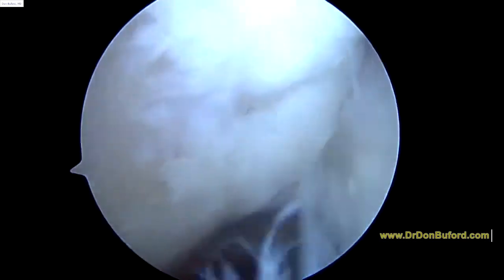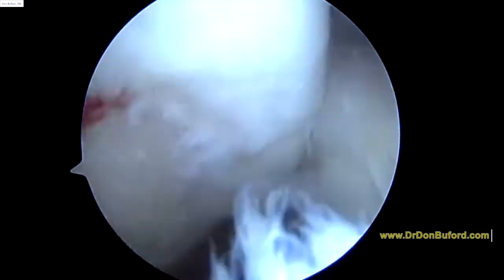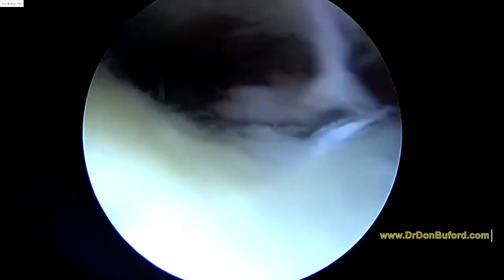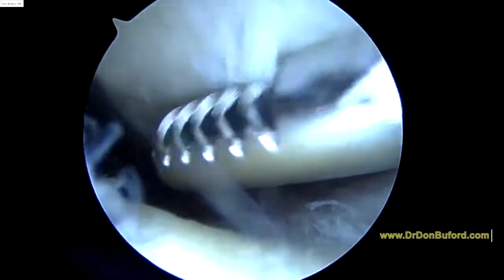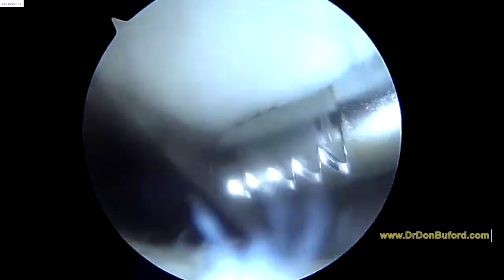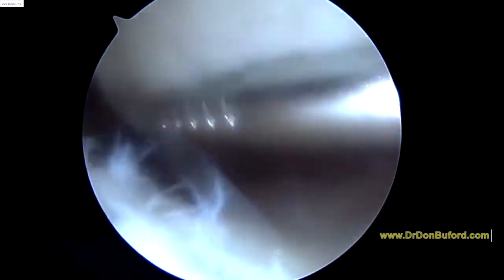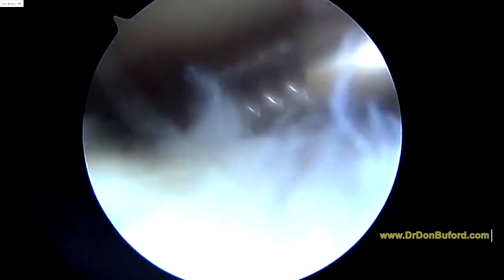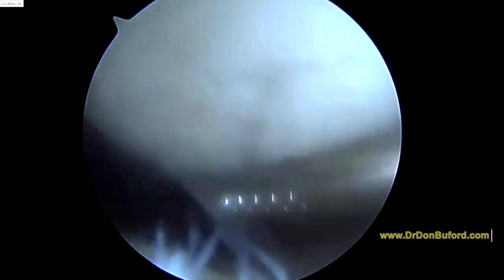I'll go ahead and look at the patellofemoral joint here. You've got some changes here, so that's really two out of the three major compartments in the knee that are going to be affected. Lateral is still the worst in what I'm seeing so far. We'll keep working on it and show you if there's anything else to do surgically. Otherwise, we're going to finish up here and get you back to recovery in just a few minutes. Good luck to you now. Bye-bye.